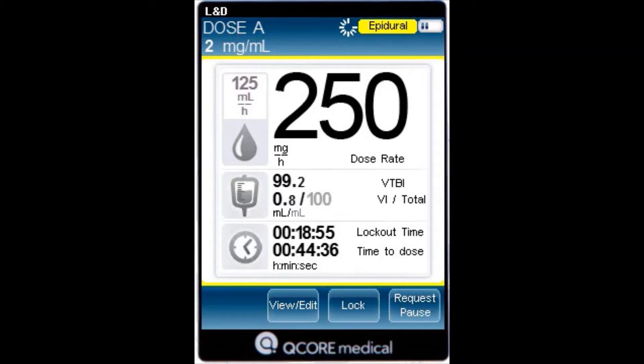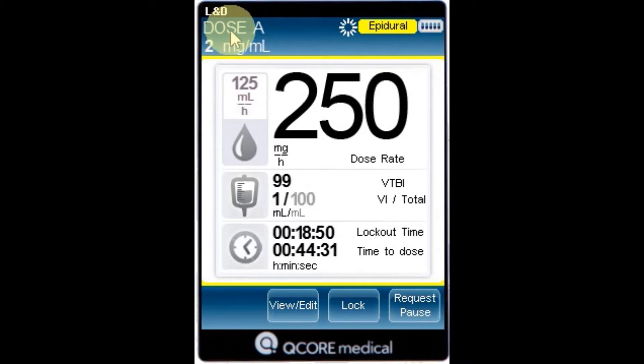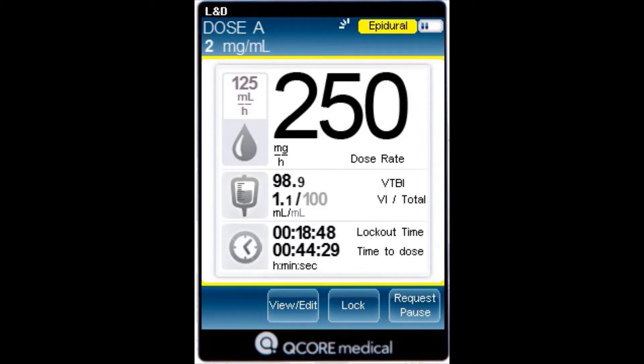The following information appears on the screen. The drug name — the name of the selected drug is displayed on the indicator bar when working with a drug library.